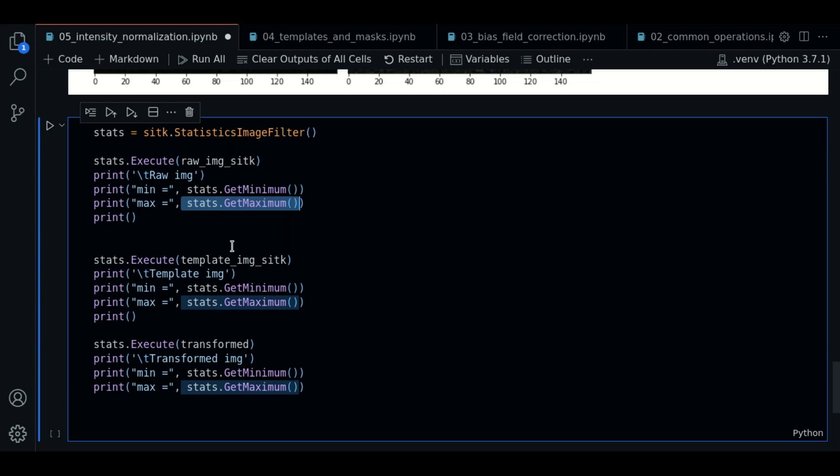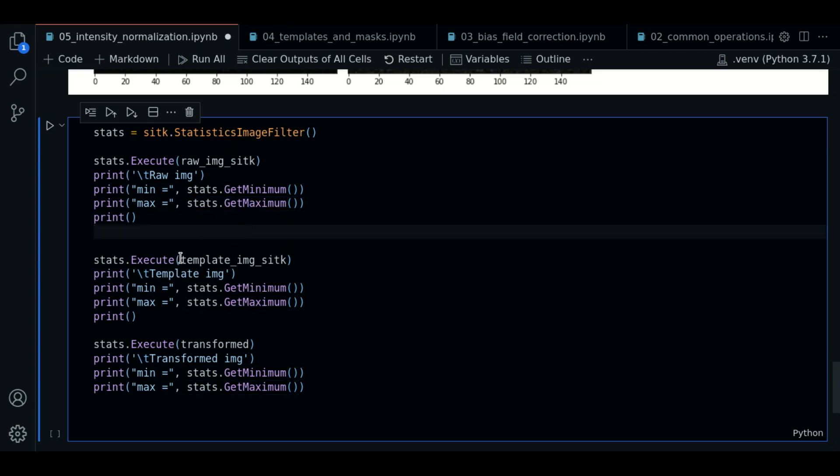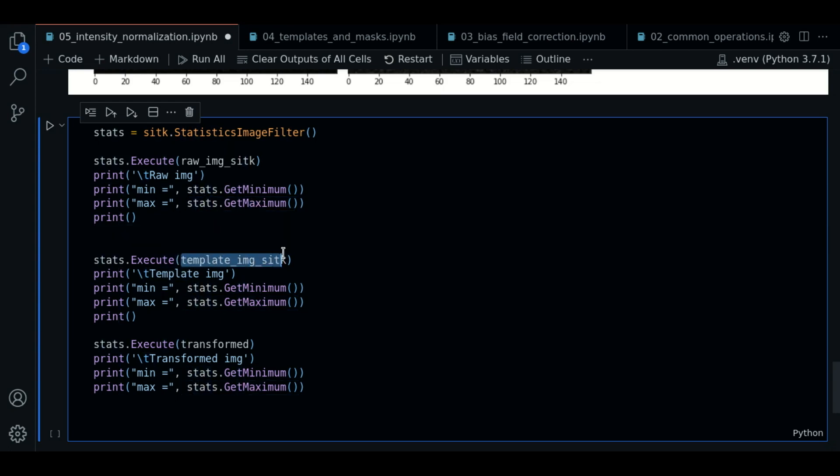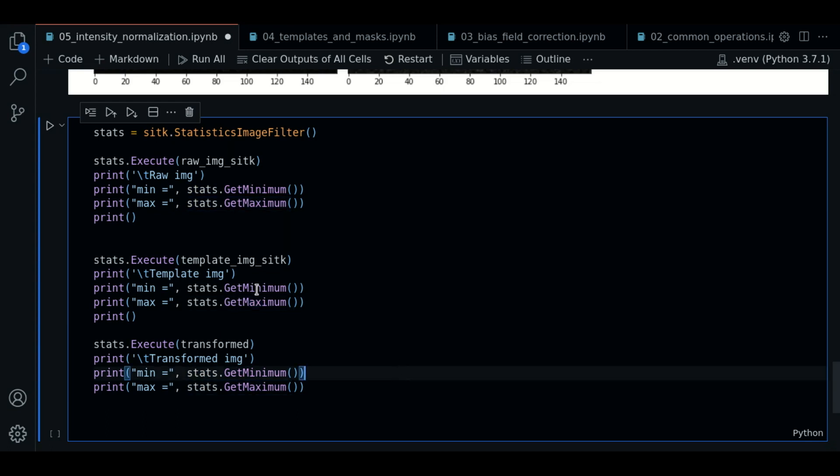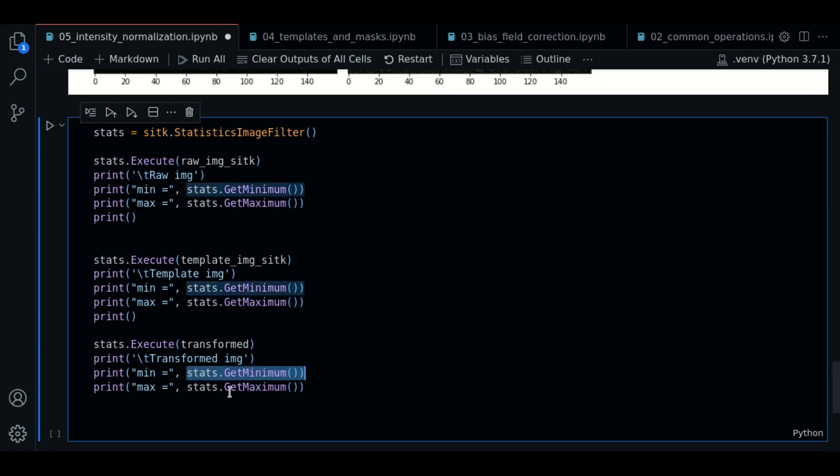We're going to compute the minimum and the maximum. We're going to do the same for the template, the minimum and the maximum. Now we're going to do the same for the transformed version.